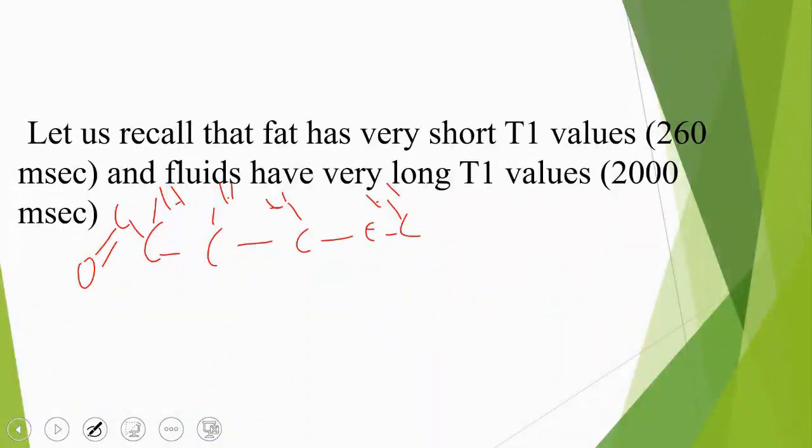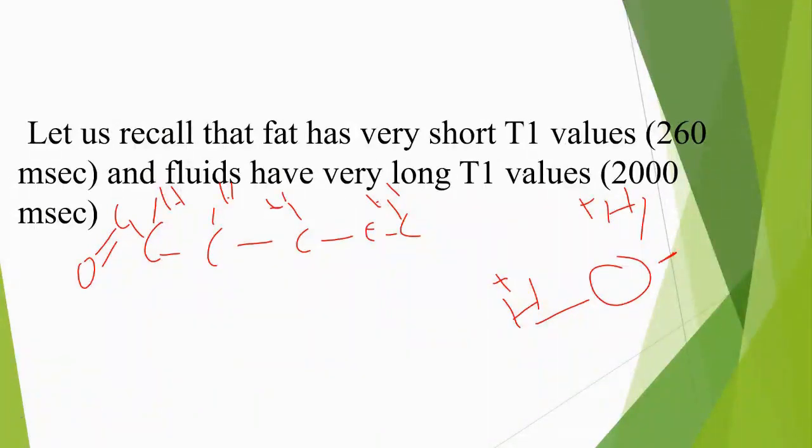It has been found that the protons in water are indeed associated with two hydrogen atoms, and the hydrogen in fat behaves in a distinctly different manner. If you take some fat and some water and carefully place them in your magnetic field, you will find that their response to the magnetic field is not exactly the same. Why? Because the structure of fat is significantly heavier. Its molecules are consistently larger than those of water, which are small molecules that move very quickly.